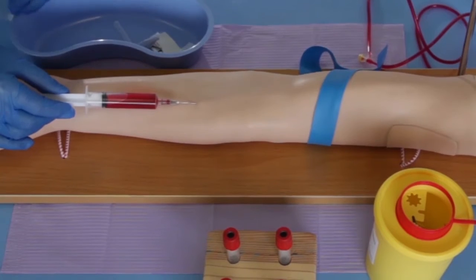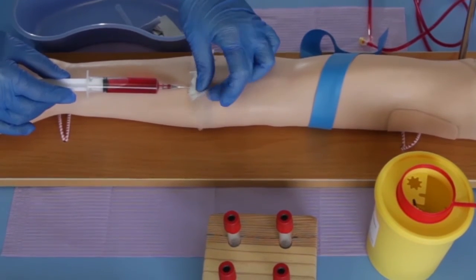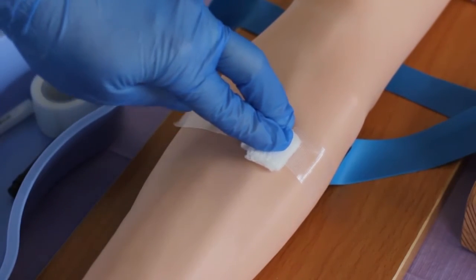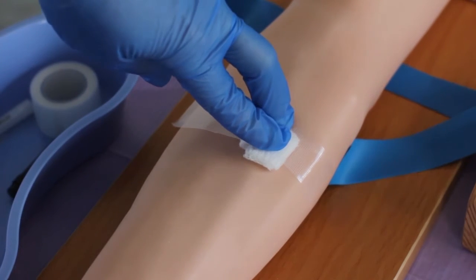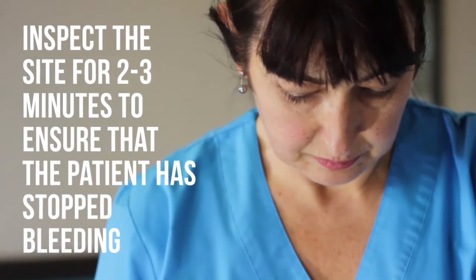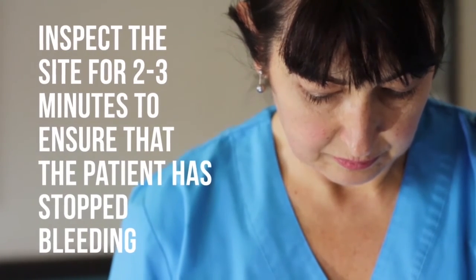Gently withdraw the needle and place a clean gauze pad or dry cotton wool ball with strapping to the site. Apply firm pressure to achieve hemostasis and avoid a hematoma. Inspect the site after 2 or 3 minutes to ensure that the bleeding has stopped.